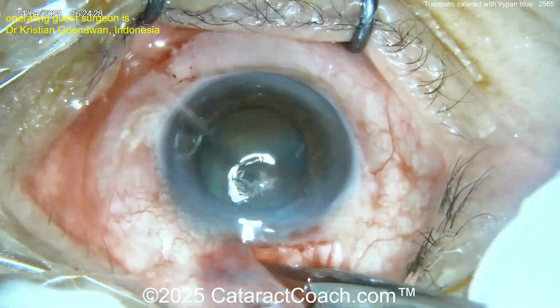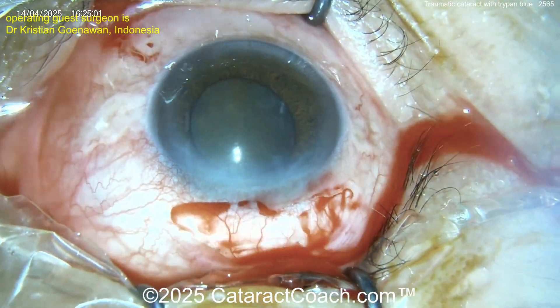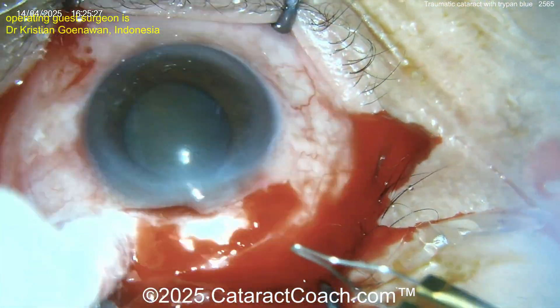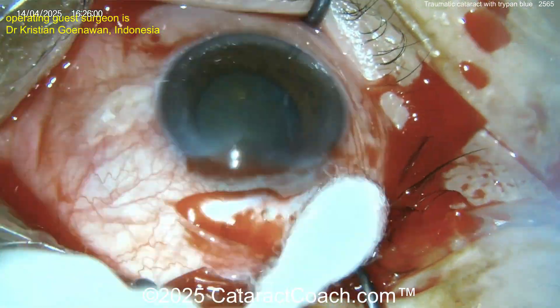The surgeon is coming in doing a superior peritomy, probably going to extract this nucleus with SICS, because that nucleus is pretty loose. A little bit of light cautery here — reasonable. You could still do phaco on this case, but I think the first step is I'd like some triamcinolone in the anterior chamber to see how much vitreous prolapse we have.